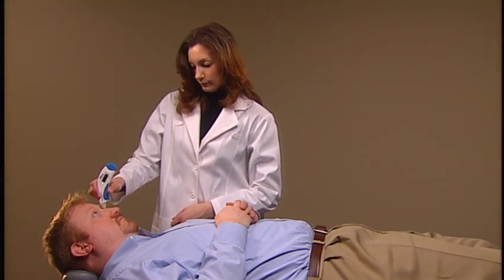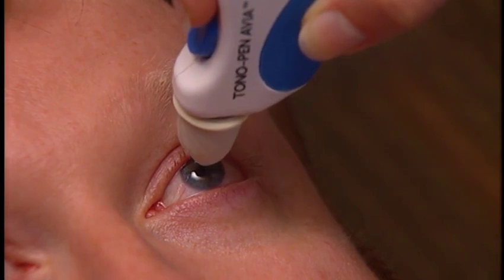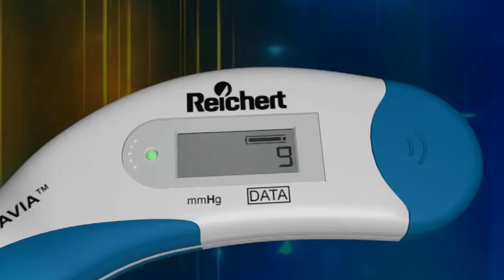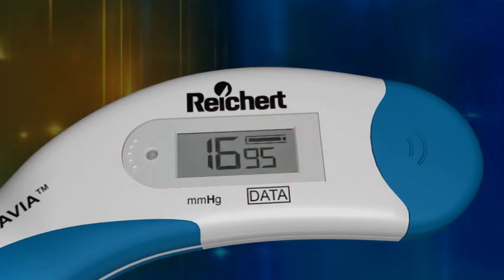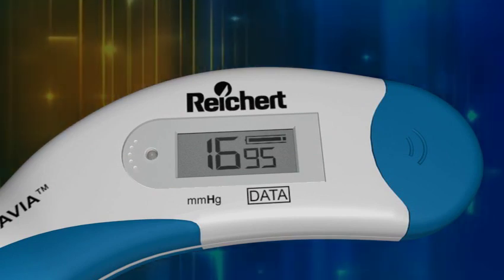Readings can be taken from any position and the patient does not feel discomfort when the device is gently tapped against the anesthetized cornea. In a matter of seconds, the LCD readout displays an average of up to 10 IOP measurements along with a statistical confidence indicator.